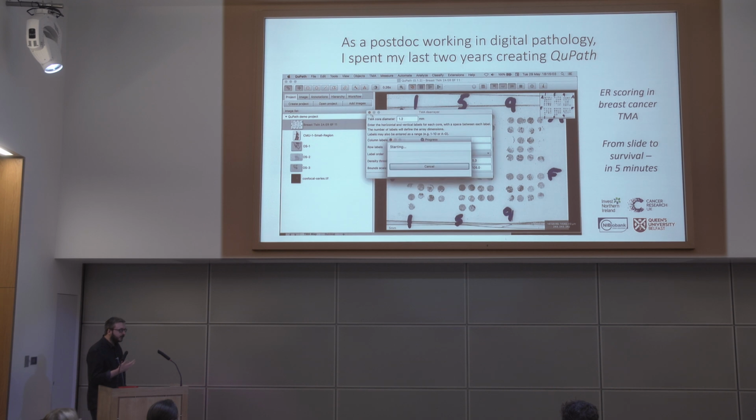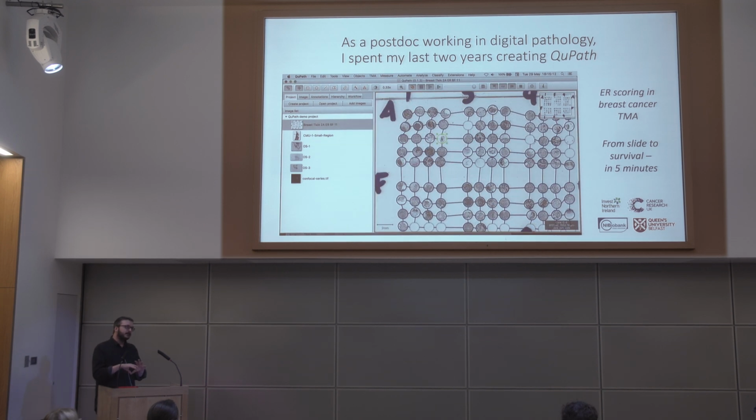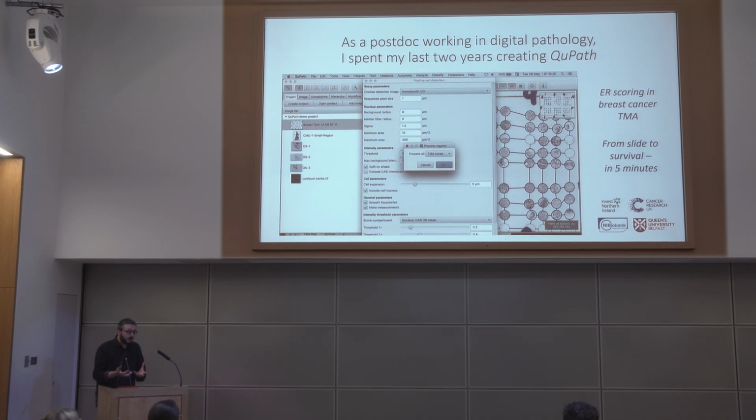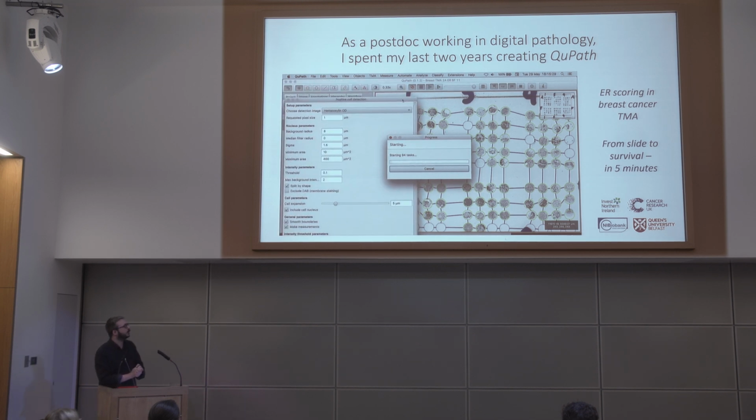So then, for the final 2 years of my postdoc, I focused on what was the platform that I would like to be developing with, or what is the software I would like to be using for digital pathology, and that's what then became QuPath. So I set about creating that. The software that I'd tried to avoid creating for 2 years in the false belief that it would be faster to try and adapt what was there before, eventually realizing that it was actually going to be faster to try and make something that was designed to do what it was supposed to do.